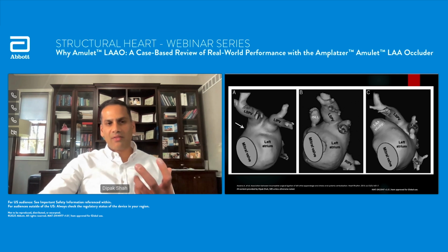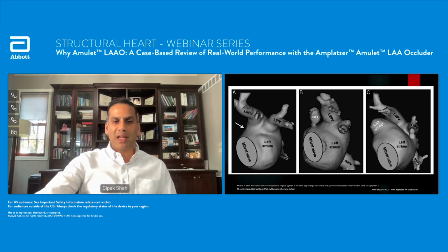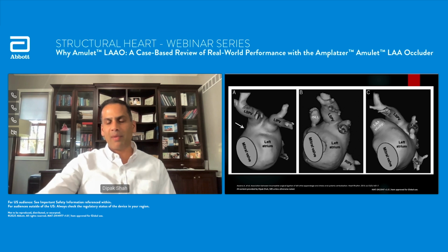So now getting to incomplete surgical ligation is really just one component of a proximal appendage where you're struggling. And so when you look at this paper here, they talked about surgical ligation with a suture bound technique. And again, usually that's not as good as a clip or amputation of the appendage. But in this paper, again, only 64 to 66% of patients had complete ligation, which was panel A. If you look at panel B, which is this incomplete surgical ligation where you're left with a neck and flow into the appendage, and that was 24% of patients, and about 12% of patients was this left atrial appendage stump, where it was this broad-based stump with about greater than a centimeter of depth.